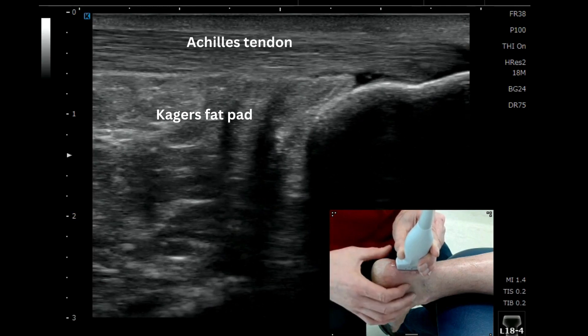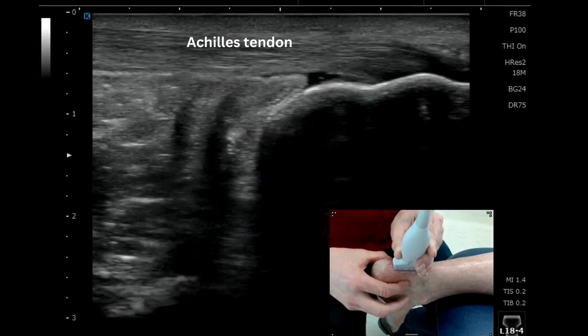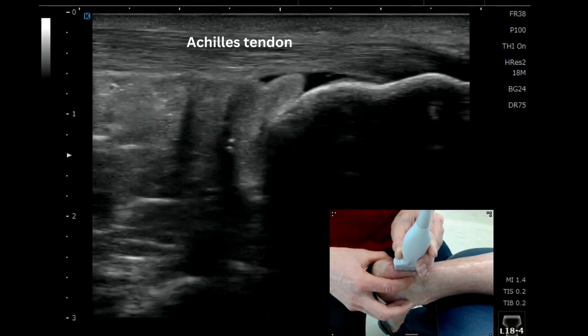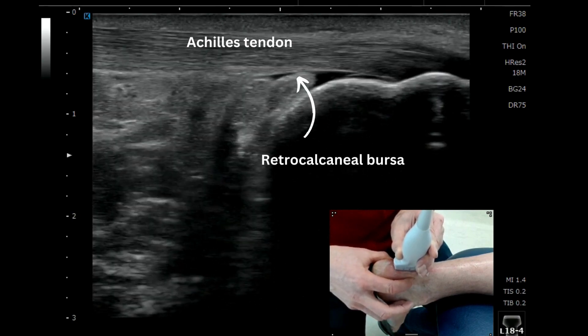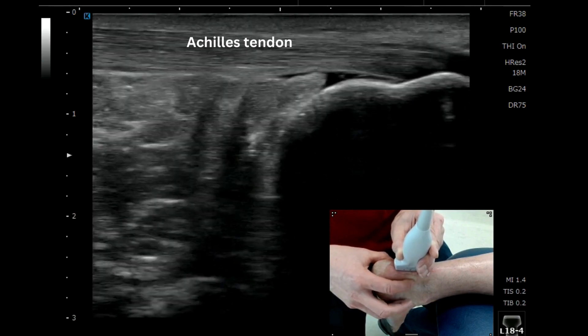Deep to that, we can start to see the CAGAS fat pad, and just proximal to the distal insertion, you'll see that little pocket of fluid. This is often quite normal, but this is the region of the retrocalcaneal bursa, deep to the Achilles at its distal insertion.